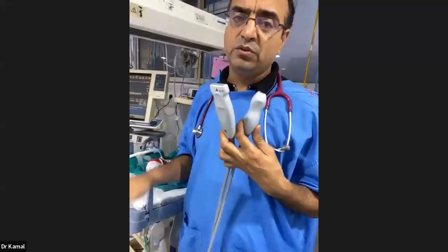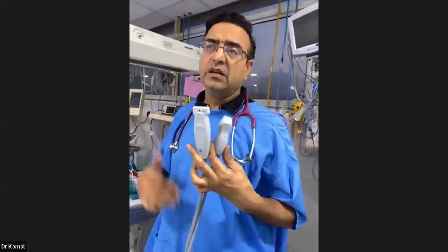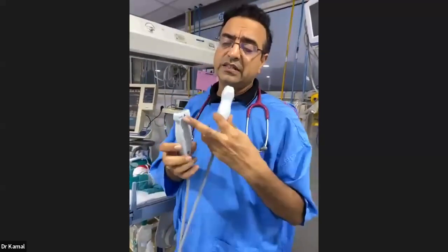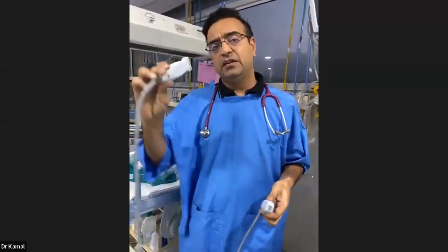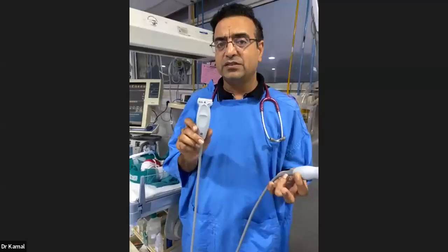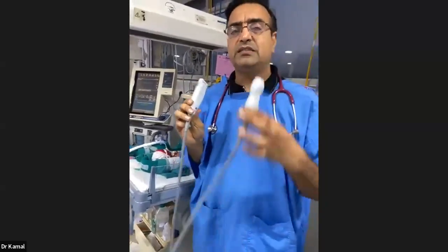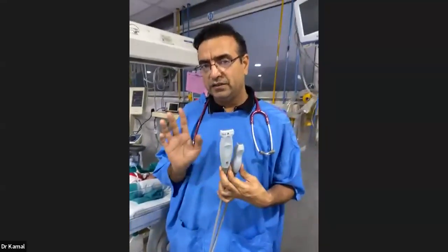We don't have a curvilinear because we don't use it in our NICU. It is used in the pediatric ICU and the adult patient, because you need more depth with this, and it will have a lesser frequency and more wavelength. Sorry. So this 6 to 13 megahertz would be having a higher frequency. So the higher frequency probe will have a superficial penetrance only. So the wavelength will be less because the frequency is high. As told by Dr. Sarjan, the relationship is opposite. Yeah. So 6 to 13 megahertz will be used for superficial structures, 4 to 8 slightly deeper, and 1 to 5 megahertz for the very deep structures. Clear? I hope that makes sense.